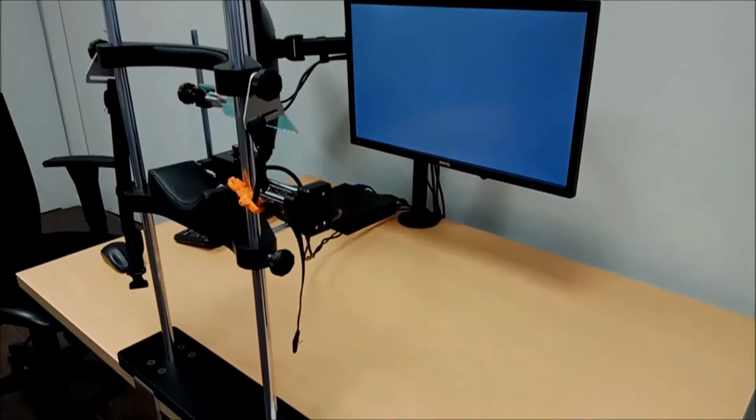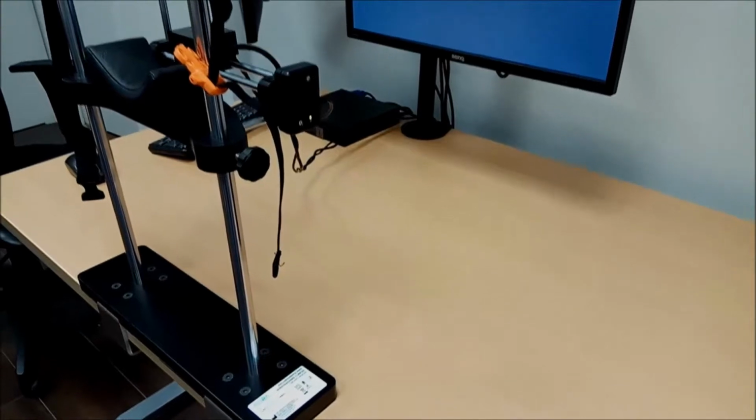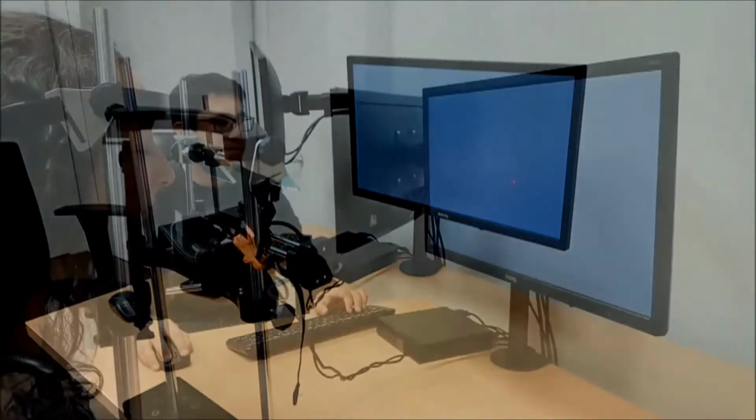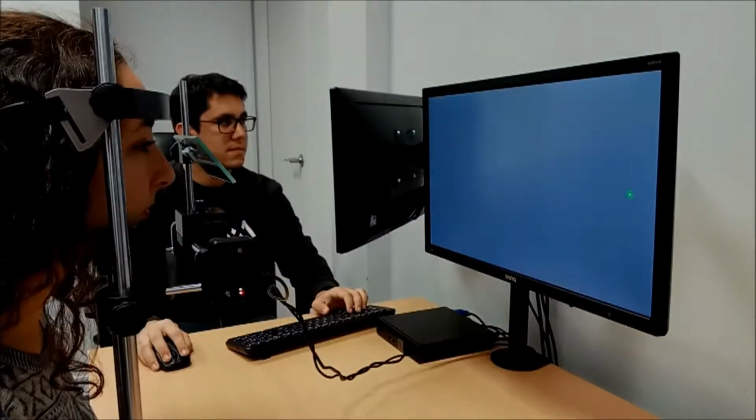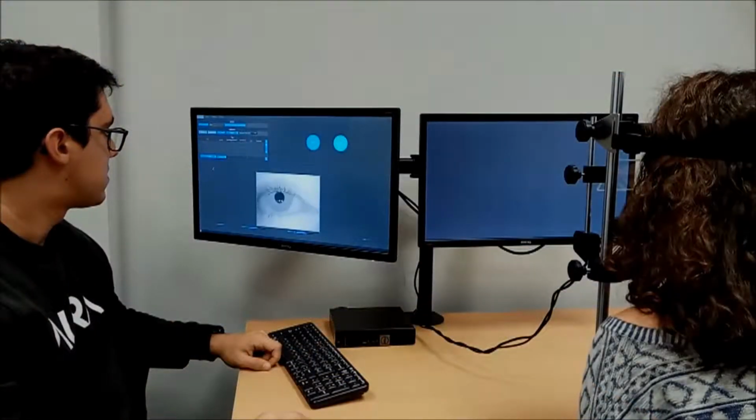OSCANN is an eye tracker designed for the study of the most prevalent neurological diseases, such as Alzheimer's or Parkinson's. The system consists of a high-speed camera able to measure eye movement alterations out of predefined visual stimulus. Image capture, stimulus control, and data analysis is performed with a single software developed by ORTE.